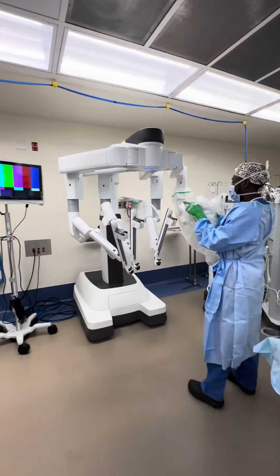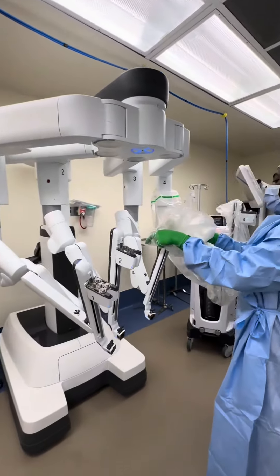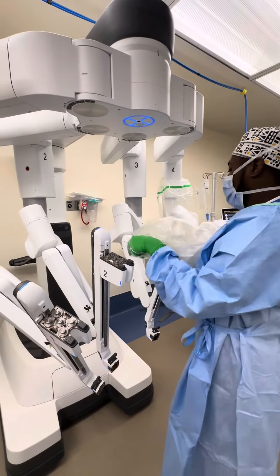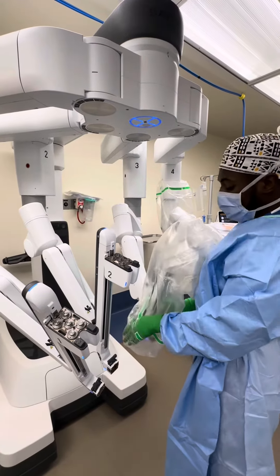Now right over the hole, you slide it over top like this, and then I kind of use my body to block the drape so that it doesn't hang down.